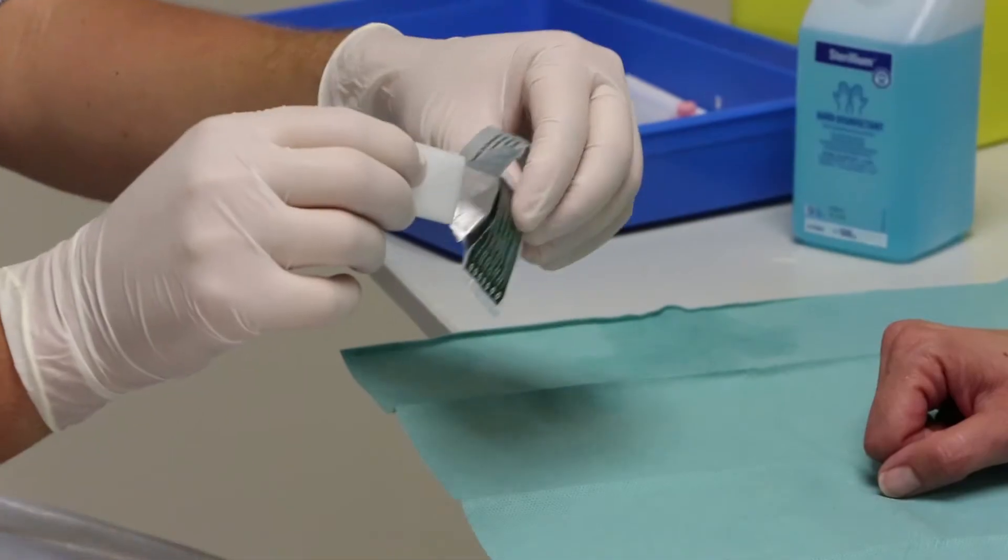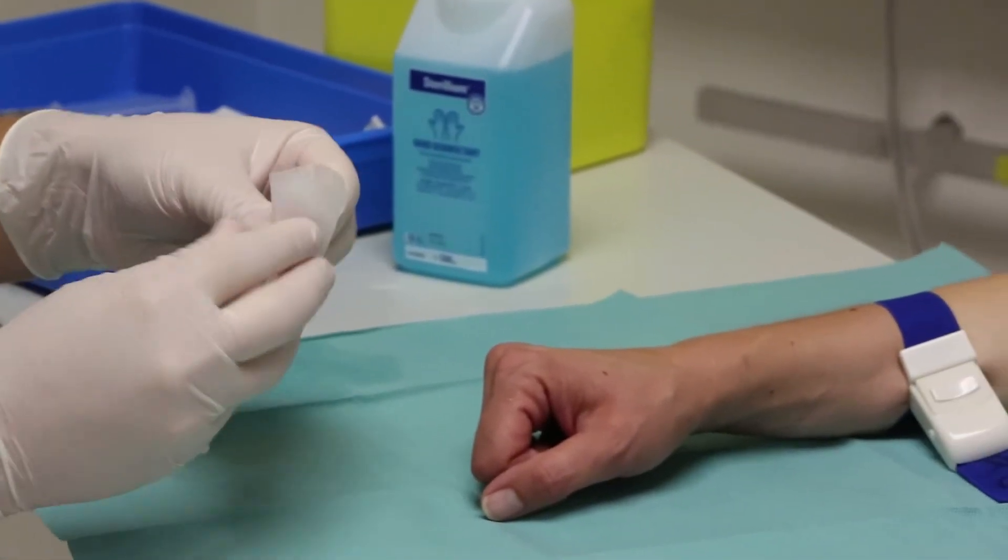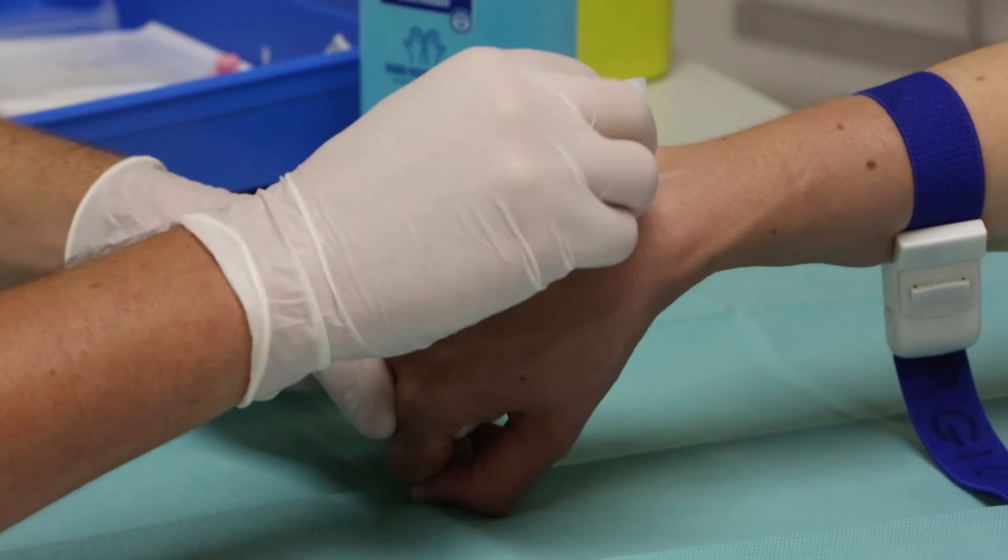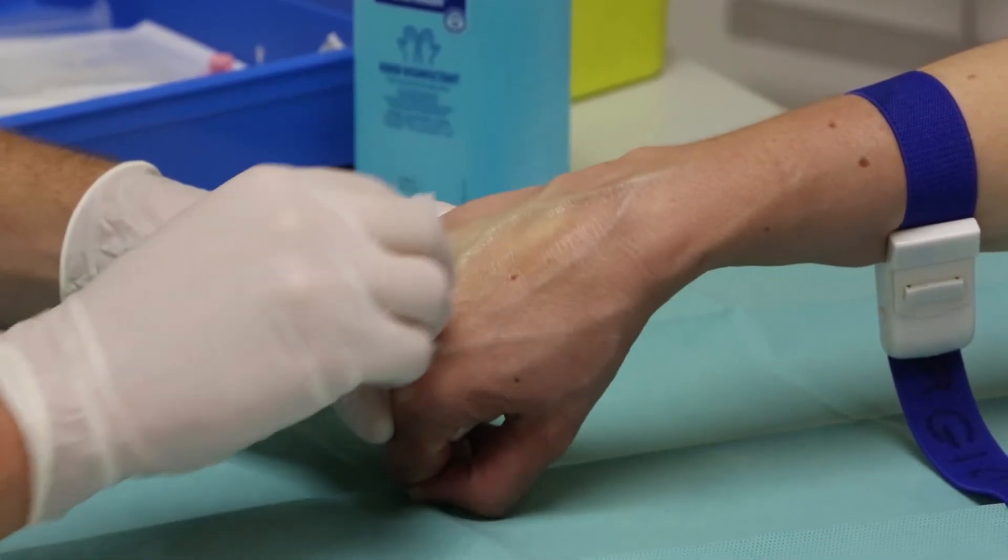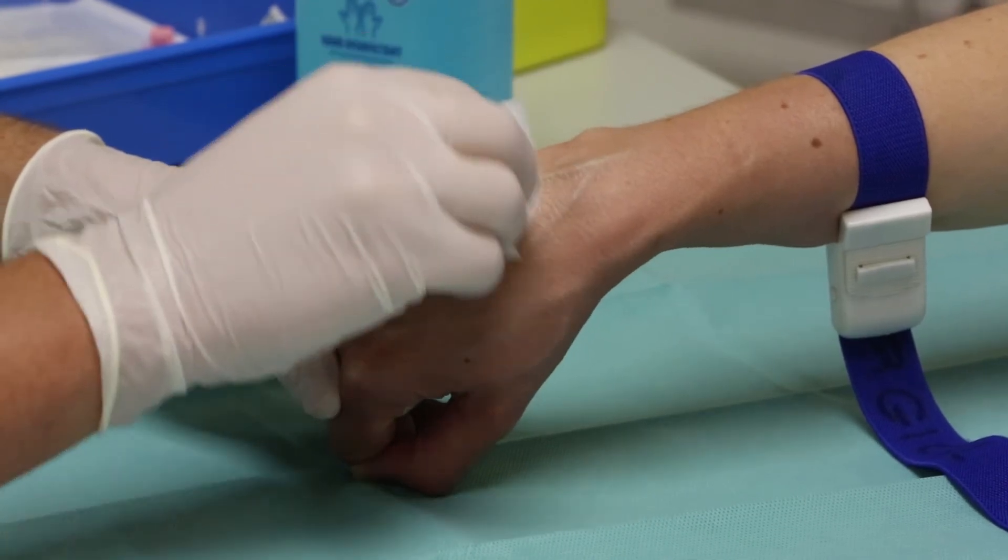Step 10. Press the applicator or swab containing 2% chlorhexidine and 70% alcohol against the skin using repeated up and down and back and forth strokes for 30 seconds. It is essential to let the skin dry completely.